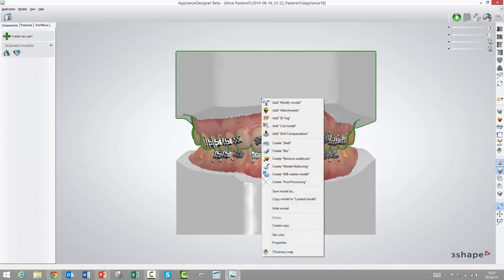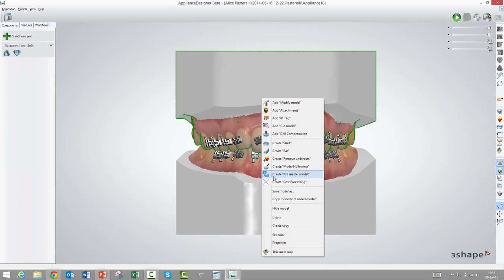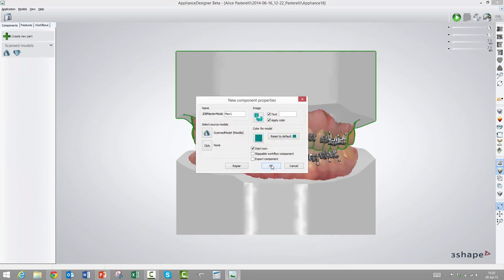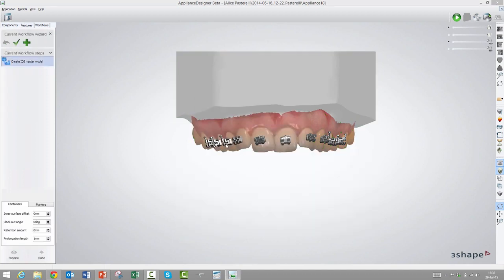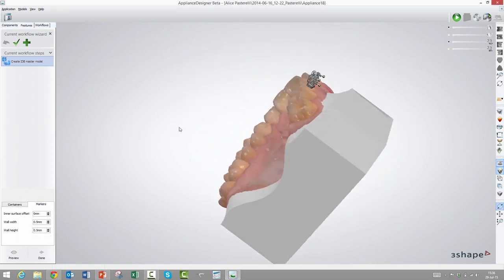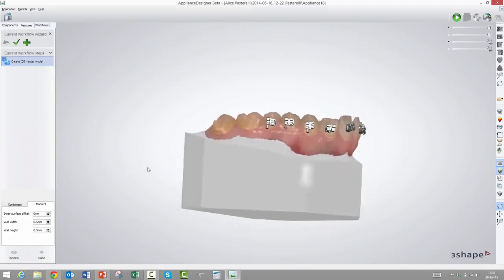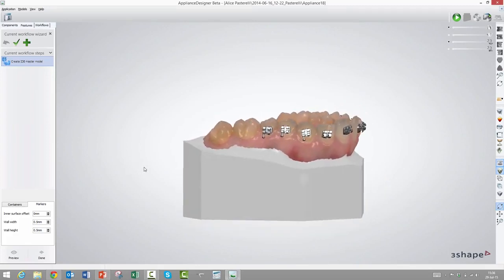You just right-click here and choose indirect bonding master model. We could change the colors and all the usual settings that users are used to from Appliance Designer. So let's start with the most simple one, and this is what we call markers.